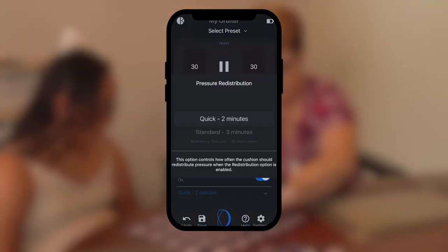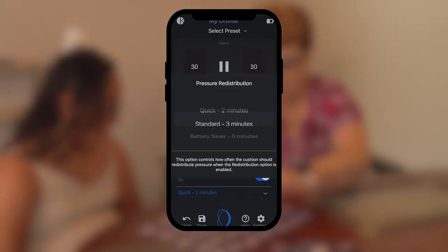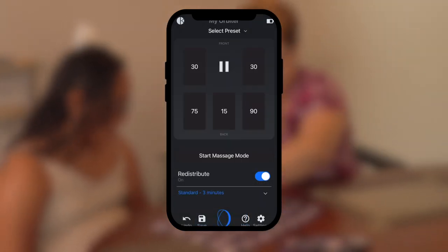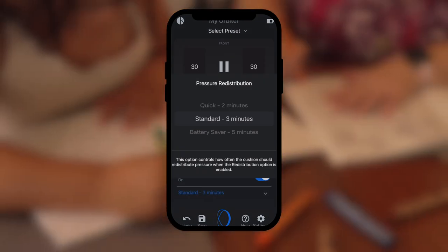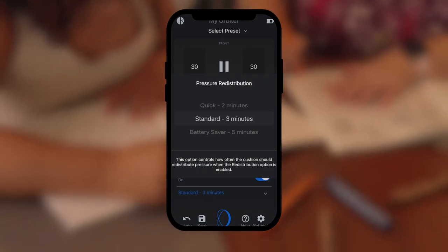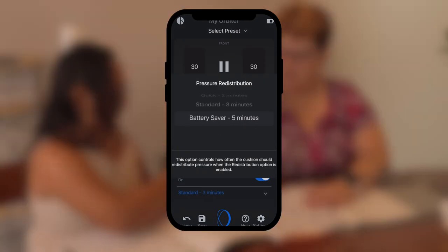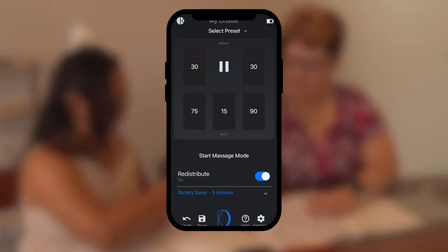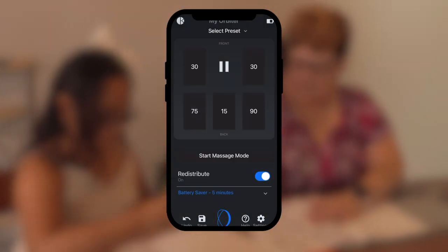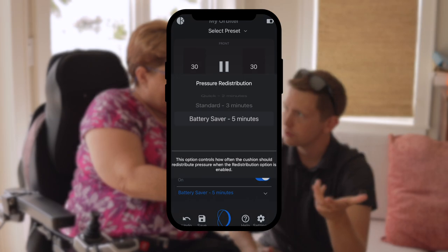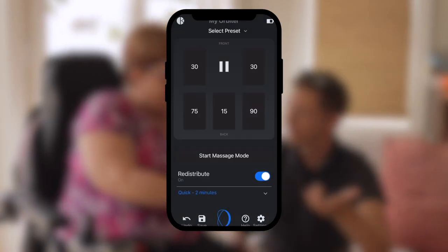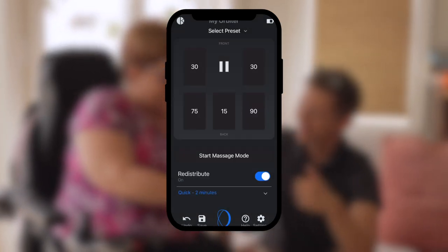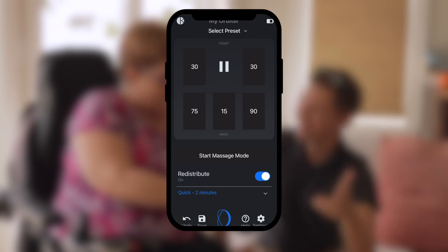After setting your pressure firmness, select how often you would like your cushion to redistribute the pressure. The cushion already readjusts every time you move in the chair, but this setting ensures that the offloads and readjustment happens at a regular cadence.